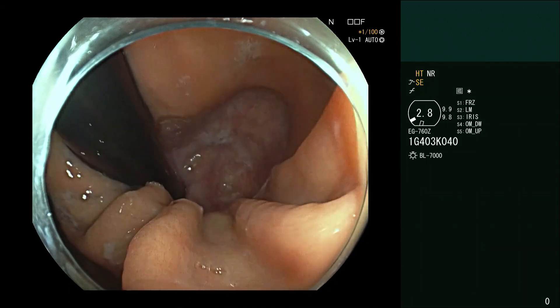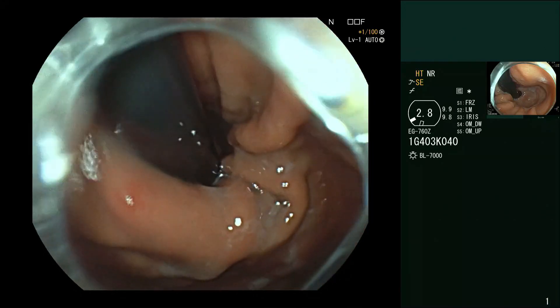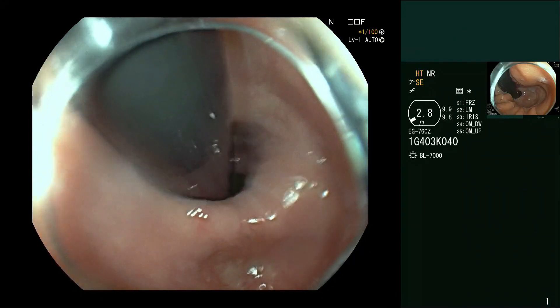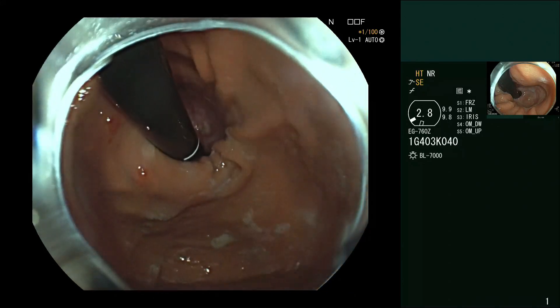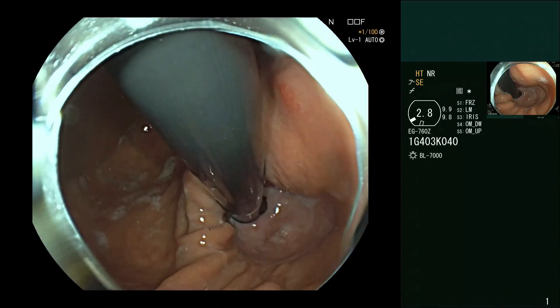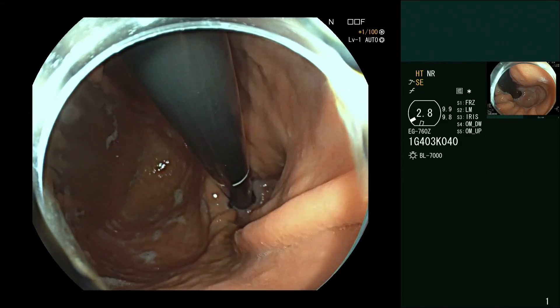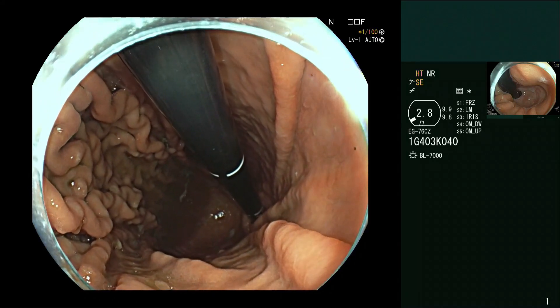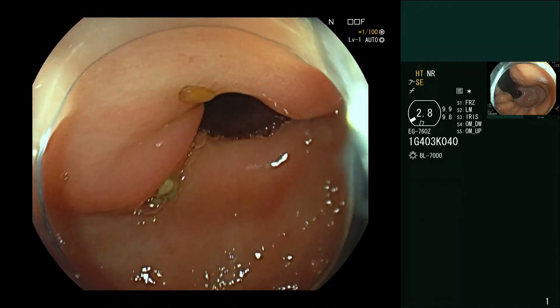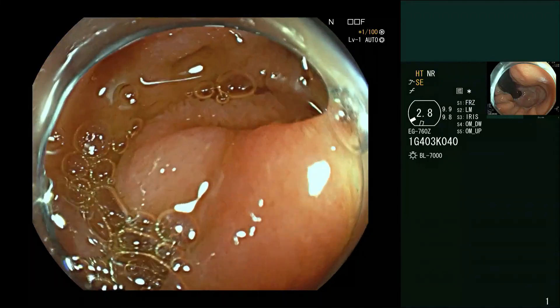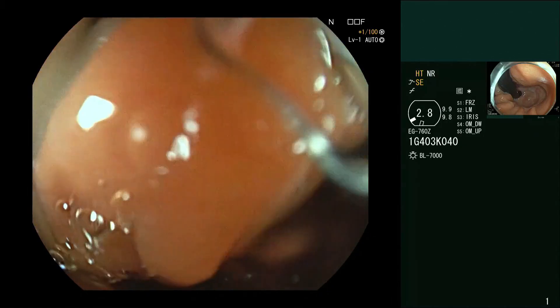We have exposed squamous mucosa to the stomach, so the patient may well be experiencing some gastroesophageal reflux symptoms, even though they don't have evidence of erosive esophagitis. This view — the ability to retroflex this endoscope into the esophagus — almost certainly suggests that the procedure to treat the LES is complete, and we certainly would not be going back to treat that LES ever again. Those patients, especially ones with junctions open like that, tend to need a proton pump inhibitor lifelong.